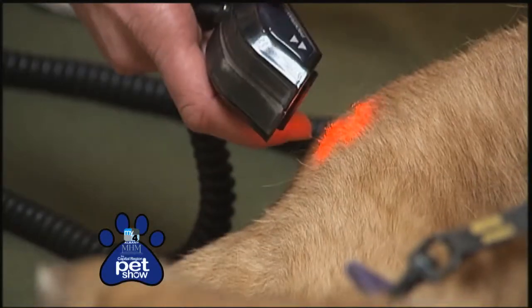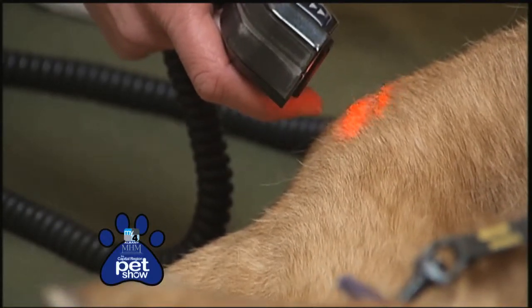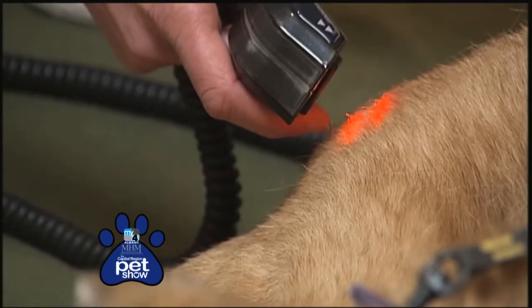The majority of the time, we're using it for arthritis in our senior pets. We've lasered dogs and cats and even a goose. And it can also be used for wound healing, any condition where there's a lot of inflammation or where we're trying to speed up the healing process. Okay, so it's an anti-inflammatory for different situations, especially with the arthritis. Correct. Okay, and how does it work?